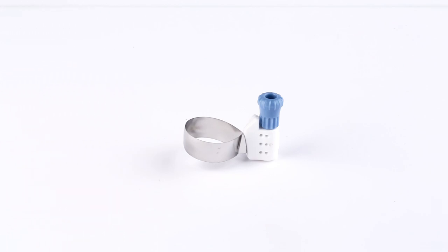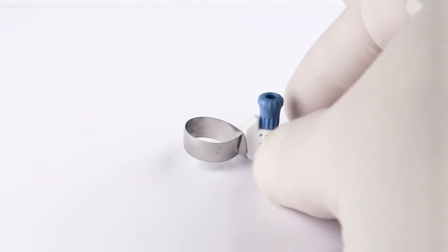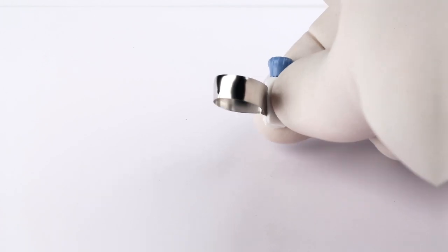No need for bulky retainers or awkward applicators. Get better access, a clear view, and greater patient comfort.